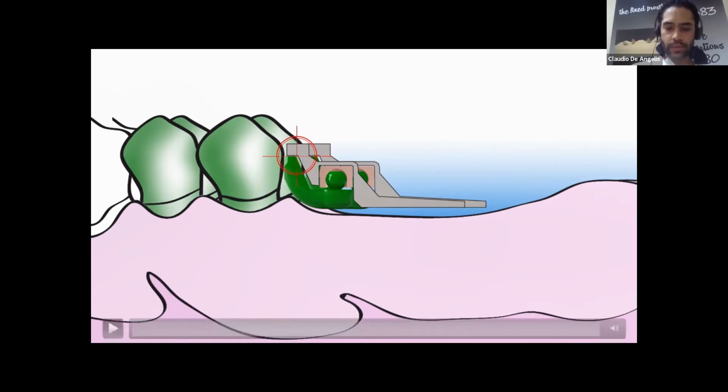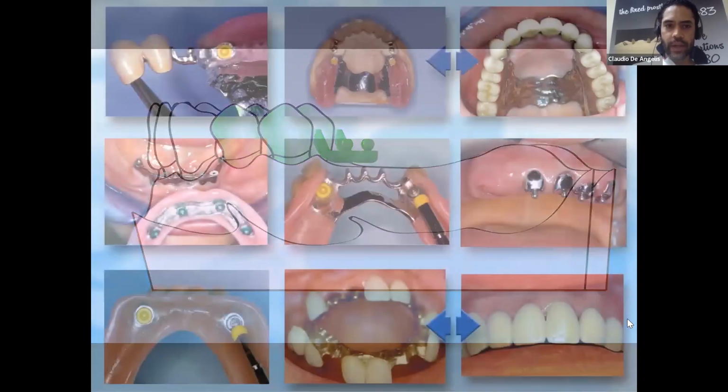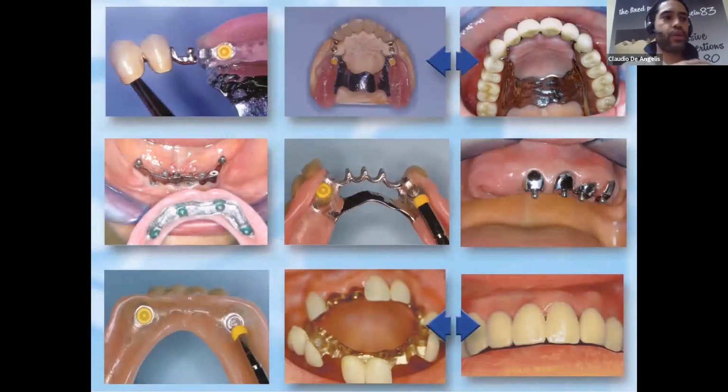Come on, next slide. Okay, so basically I give you the basis to understand Otica. Remember it is available in 2.5 and in 1.8 size, okay? The 2.5 is the green, the red one is the 1.8, the micro size. And this said, you can use it as you want.